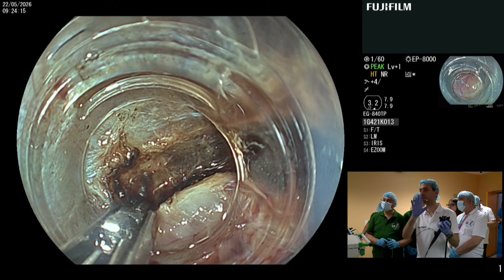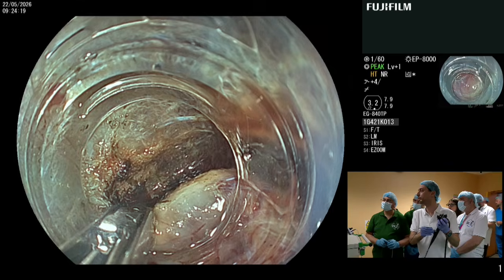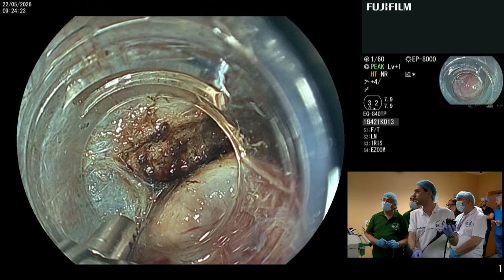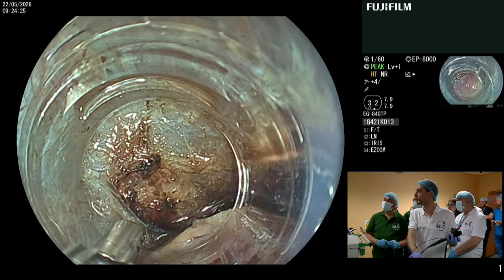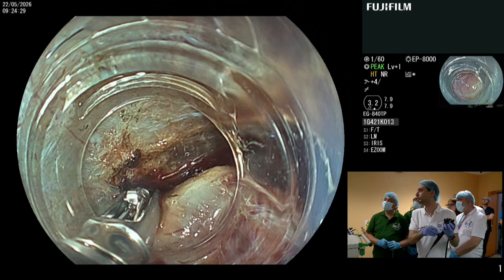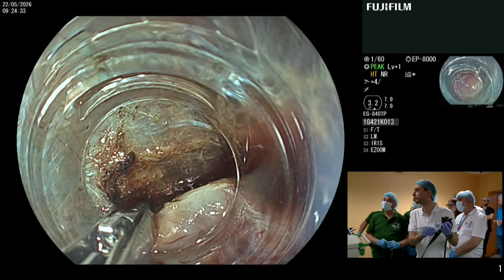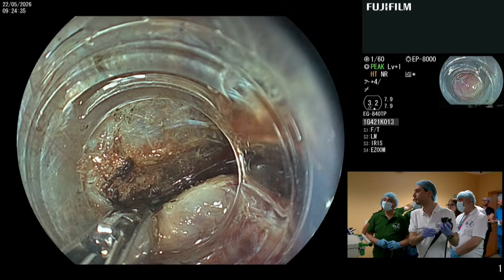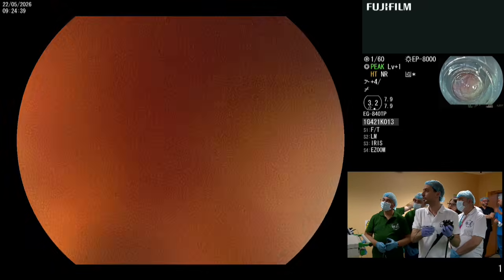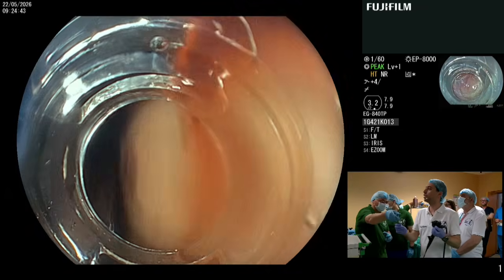I press the pedal for 1 or 2 seconds. Okay, stop. Open. Now I check whether we have a good hemostasis. It's not perfect. One more time, and then I will stop. Close. I pull back. I touch the tumor, but open. Okay. I will stop, and if it continues to bleed, I will dissect the area around later. So I aspirate again.